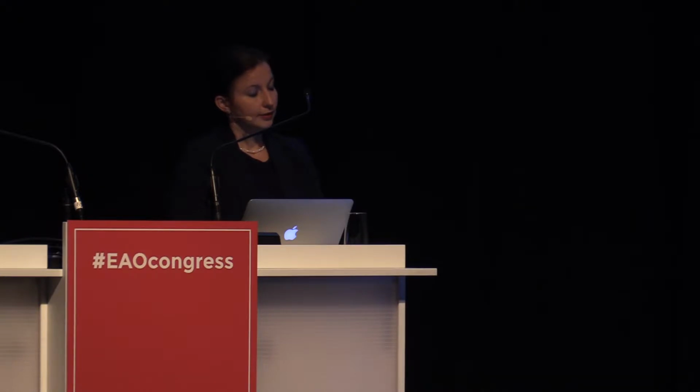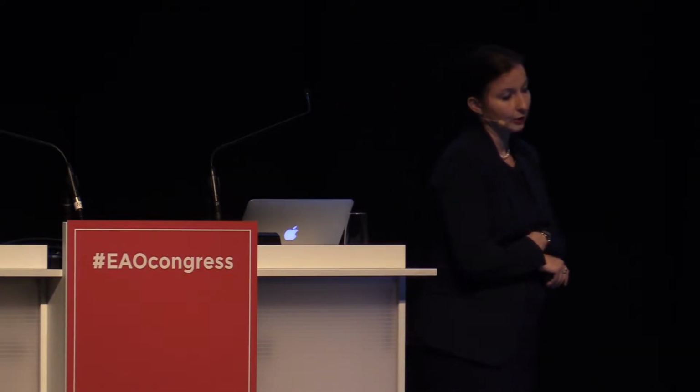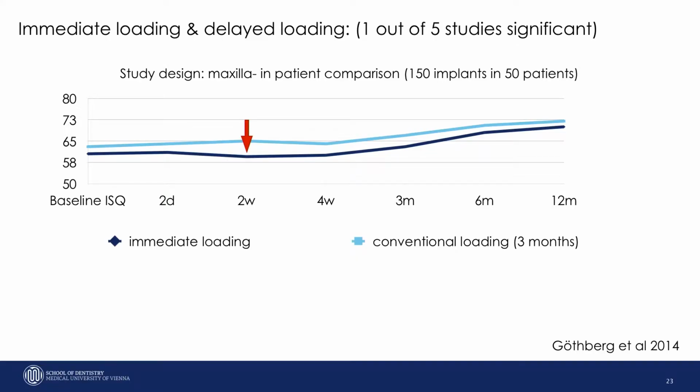When it comes to immediate loading and delayed loading, the dark blue line is immediate loading, which means the implant was placed and loaded. You can see that when you underwent conventional loading, which means that in the graph the light blue starts after 3 months, you can see that when it's loaded immediately, there is a decrease in implant stability after 2 weeks and 4 weeks, which is significant compared to conventional loading.